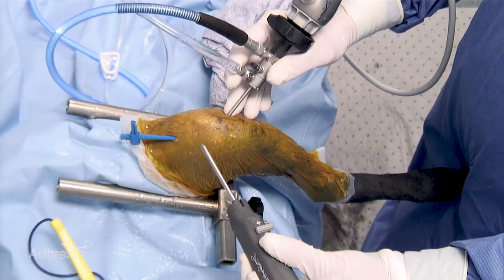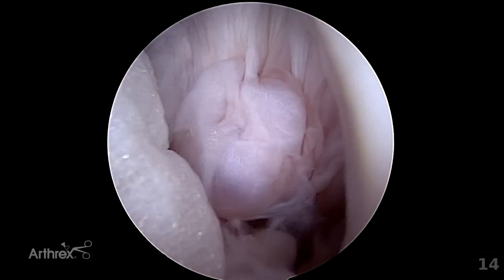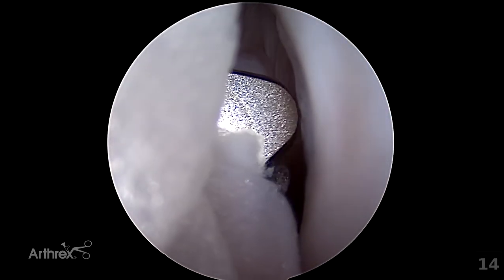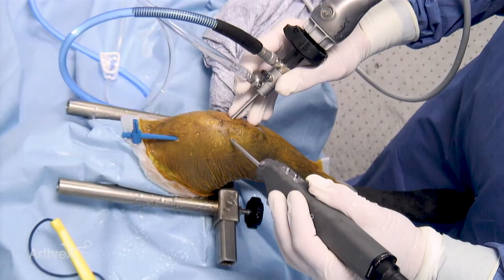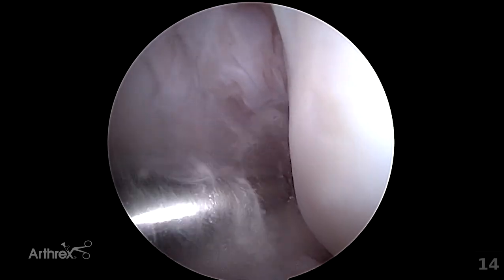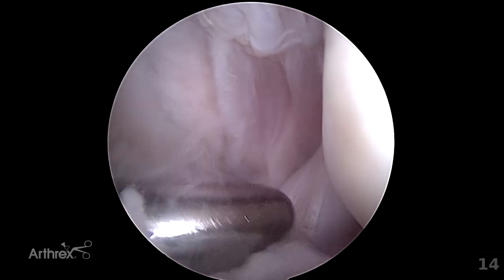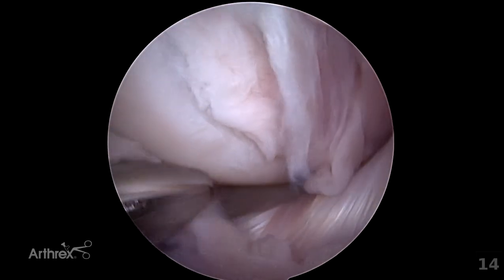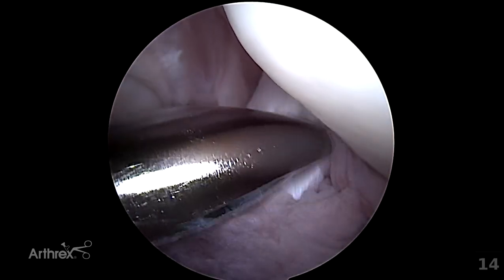At this stage it is appropriate to place the shaver. The 4mm torpedo shaver is placed through the medial portal. The challenging portion of arthroscopy is triangulation, and it is important to attempt to visualise the tip of the shaver within the groove. The shaver can be commenced in an oscillating fashion. Suction can be initiated on the shaver handle and the intra-articular fat can be progressively divided. Shaving should be judicious and careful, and should not damage the normal architecture of the cartilage or ligamentous structures. When the tip of the shaver becomes inapparent, shaving should be ceased immediately.